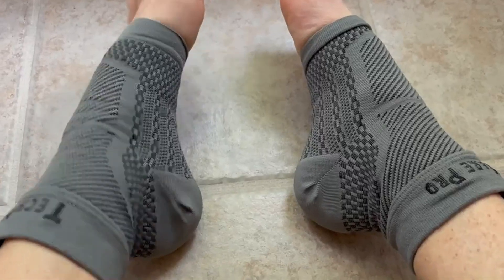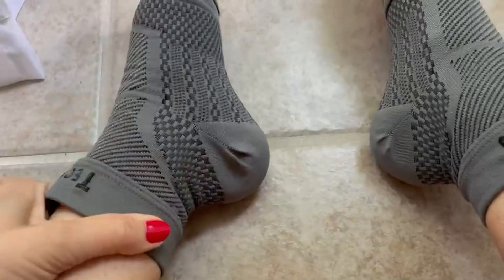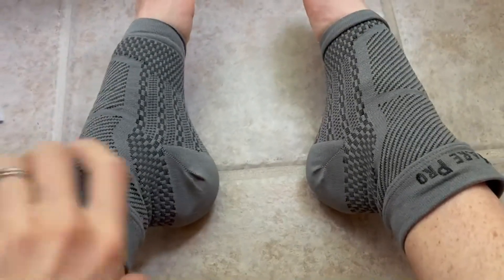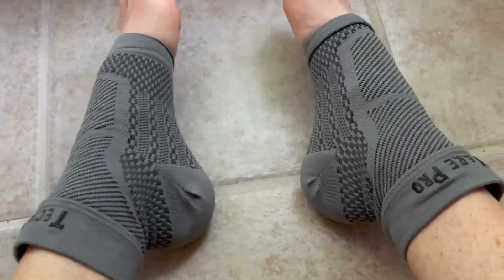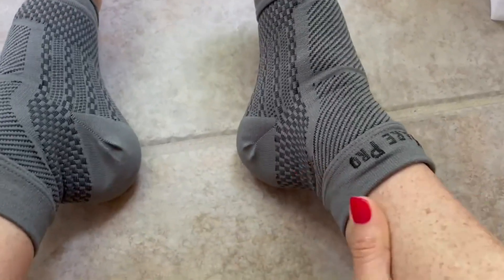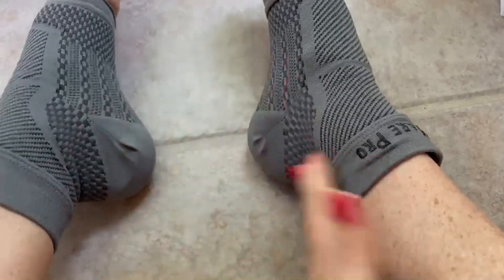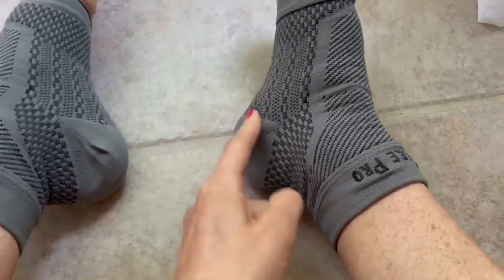I wanted to do a review on these ankle braces. I got them because I had an Achilles injury a couple years ago and sometimes it can feel a little wonky, and I know I need some extra support. I got these for that reason because they do help support your Achilles.